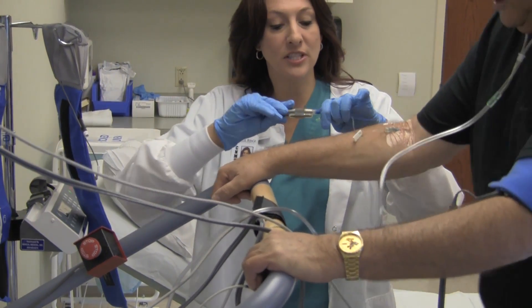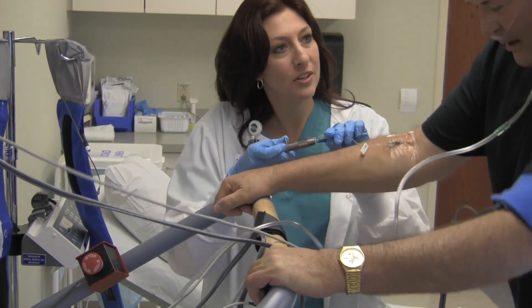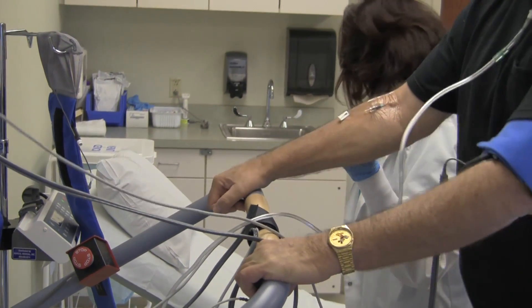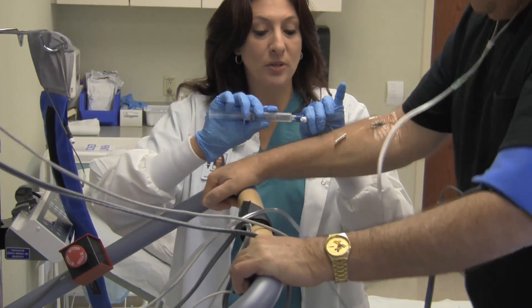I'm going to give you this radioactive tracer. It's not harmful to you and it doesn't make you feel funny or weird. One more minute left walking and you're done. You're going to allow us to take pictures. I'm going to give you some saline to flush this tubing out.